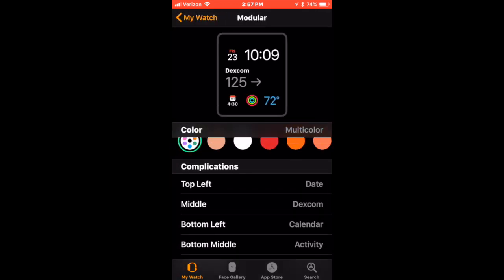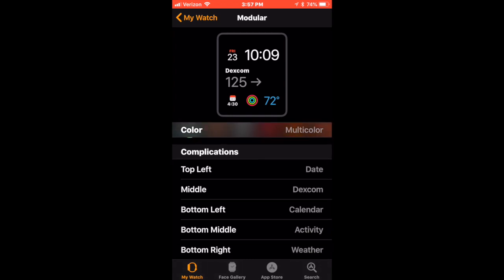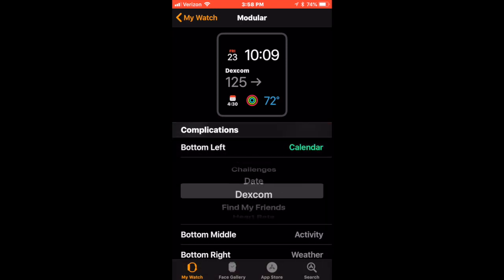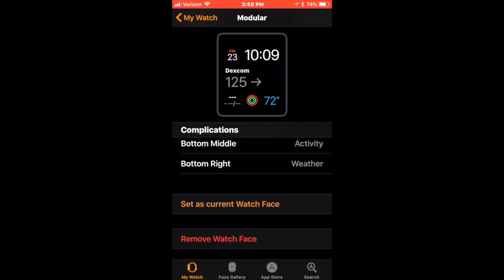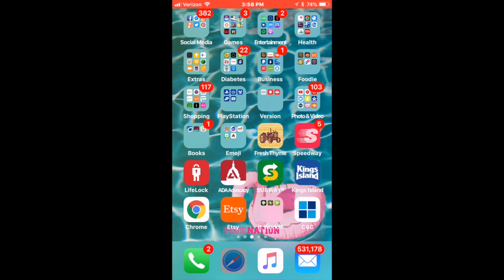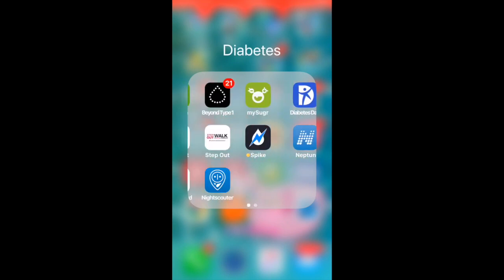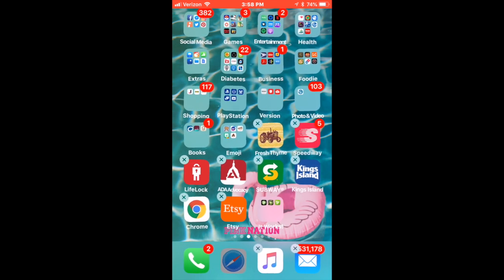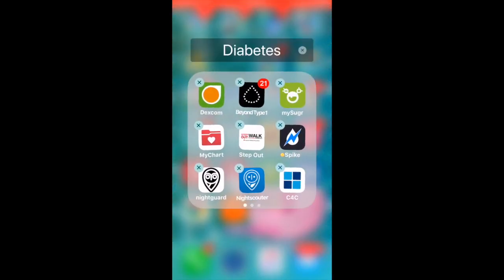I set that up as a current option, and I also showed you Modular, which is the one I've been using lately. I have my Dexcom set up in the center, time and date at the top, activity and weather, and on one side I'm setting up NightScouter so I can compare how accurate Spike is to Dexcom — I'm really curious. That's what's currently showing on my watch right now, so I'm just waiting for the Spike readings to come through. If you don't get it set up successfully the first time, keep trying. If you have a lot of apps running with Bluetooth — like my Dexcom running simultaneously — it may prevent readings from coming through. I actually had to set it up more than once.